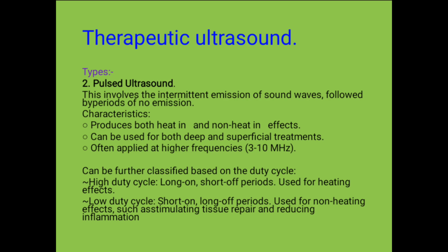And this pulsed ultrasound is further categorized based on the duty cycle, and we have the high duty cycle and the low duty cycle. And the high duty is majorly used for heating effects, and the low duty is actually used for non-heating effects, such as stimulating tissue repair and reducing inflammation.